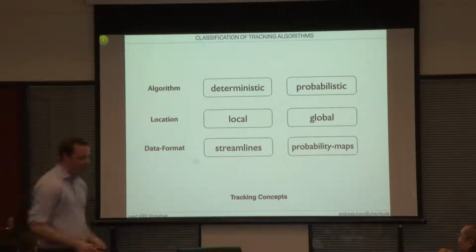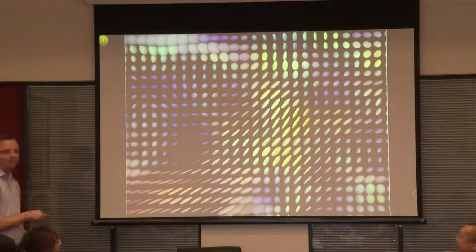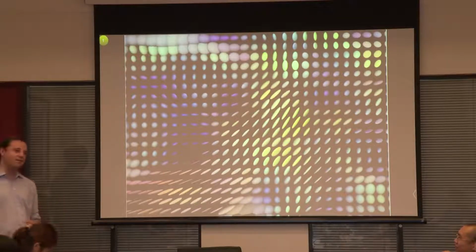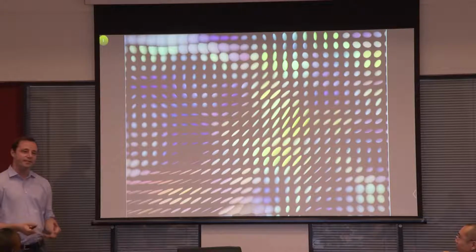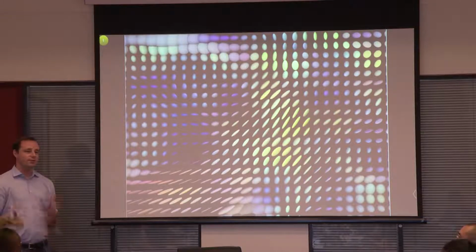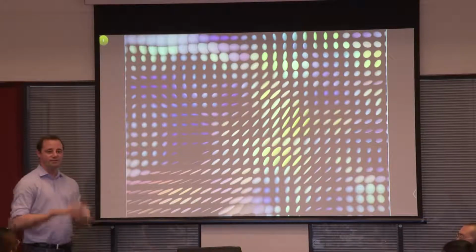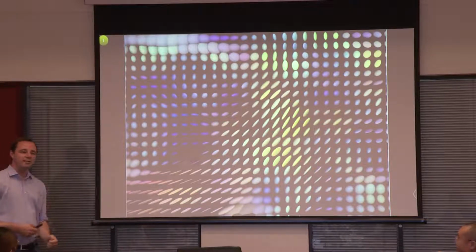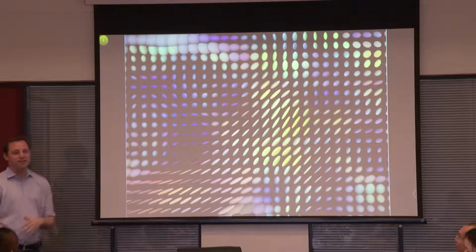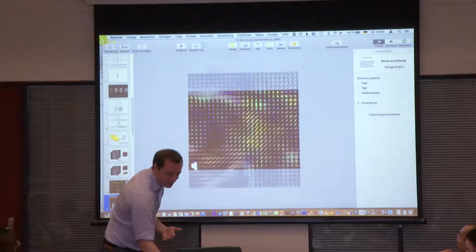Much more important than that is really what model you put here. Right? What model do you model your voxels with? Is it a tensor? And that's really old school. Nobody does it anymore. I still explain it this way because it's the easiest. But usually we have much more complex models here that have multi-tensors or Q-ball or Q-shell imaging, whatever. There are so many things, spherical deconvolution, and so on. So that choice, in my view, is much more important than whether you do a probabilistic or deterministic tractography. Which is actually essentially whether you add noise or no noise to the data, right?